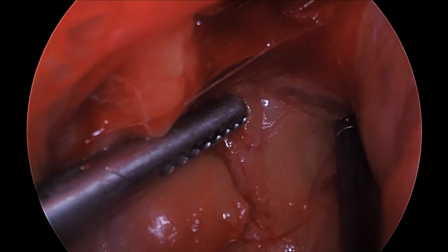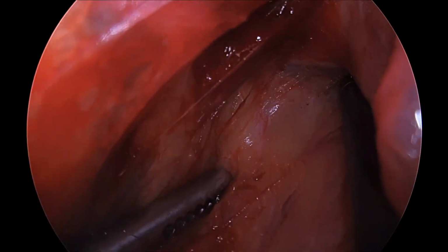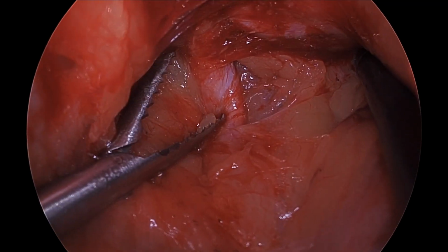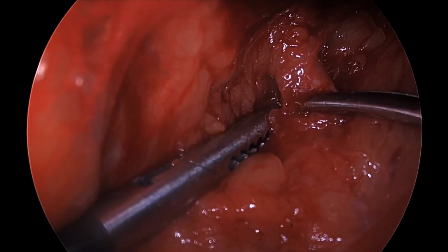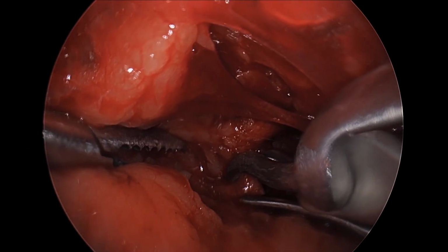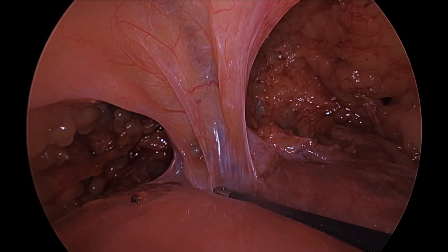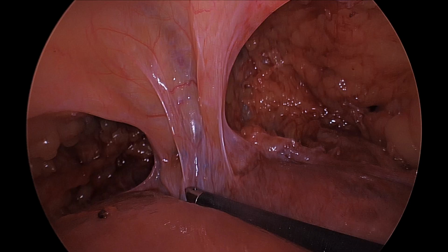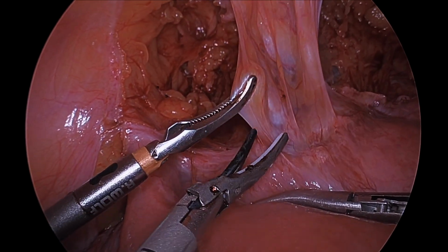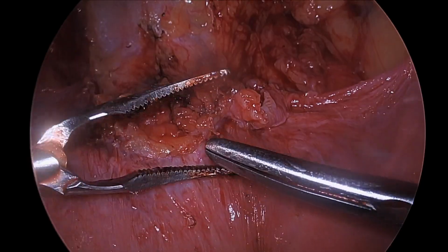Securing the internal iliac arteries bilaterally provided mechanical hemostasis prior to introducing a uterine manipulator. In this case, a Volchev manipulator was used only after the arteries were secured so as to limit potential hemorrhage. The vesicouterine peritoneum is now dissected, and the previous development of the paravesical spaces bilaterally facilitated this significantly. There's minimal tissue left to finish the bladder flap.